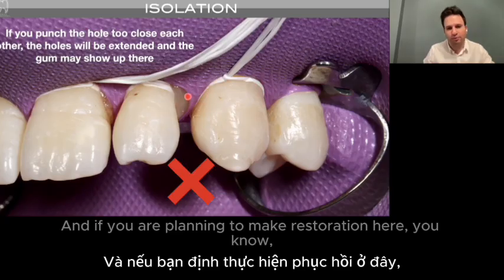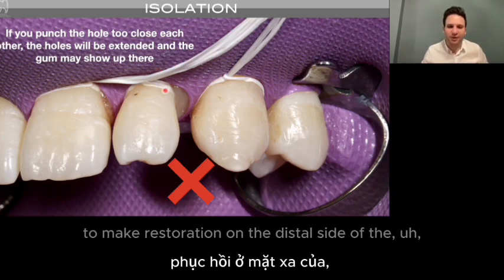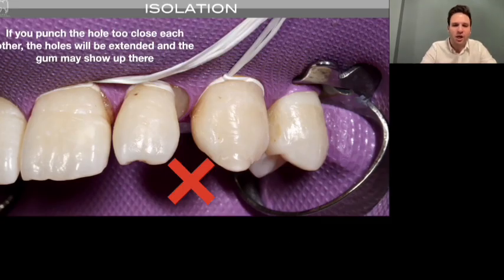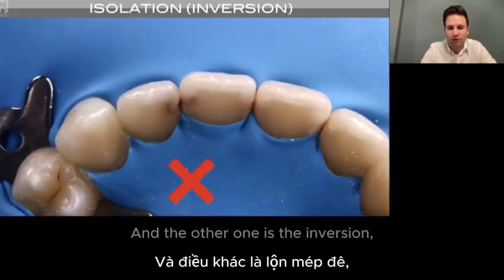And if you are planning to make restoration here, it's almost a non-isolated area. But that rubber dam still isolates the lips. If you are planning to make restoration on the distal side of the lateral incisor, the tooth is still in a non-isolated condition. So we should be careful when we are punching the holes. And the other one is the inversion.